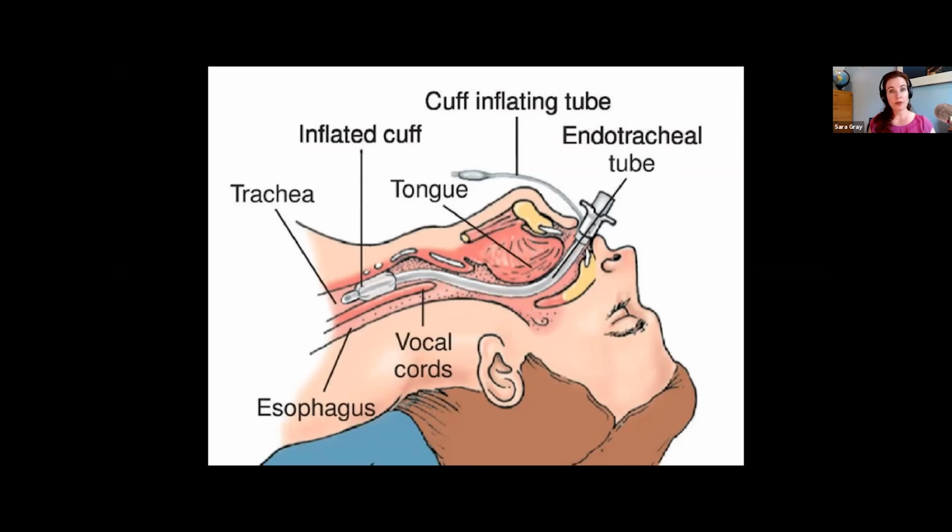So you want a cuff leak to be present. And this is an easy thing to check for, just not something that we do very often. So if you have a friendly RT, they'll typically come and do this for you.